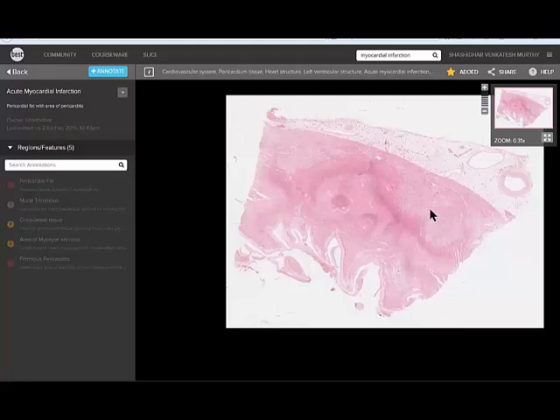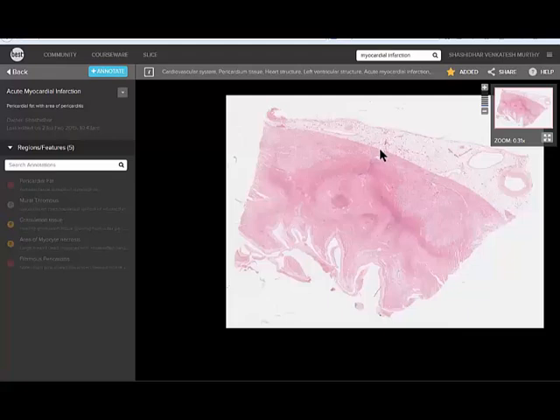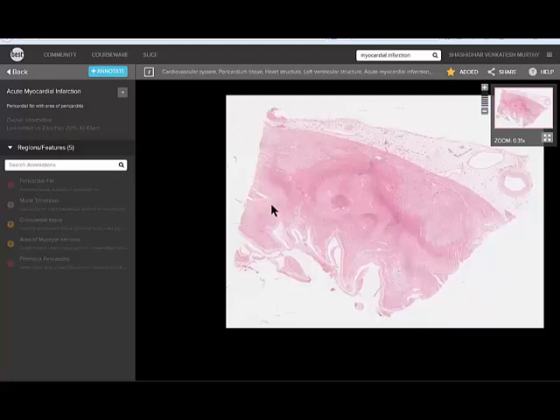The dead cells appear more reddish. And also, the hemorrhage adds to the reddishness under the microscope. This area is actually dead myocardial tissue. From outside, the healing starts after 3 to 7 days by forming granulation tissue. Earlier changes which starts from the endocardium.